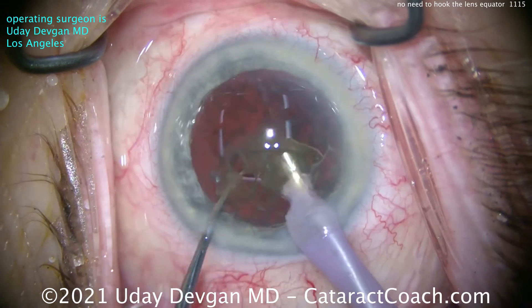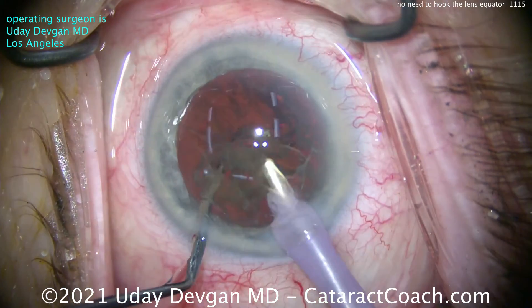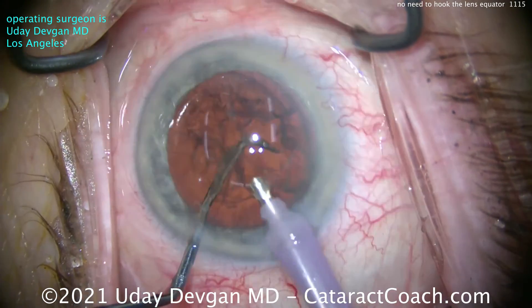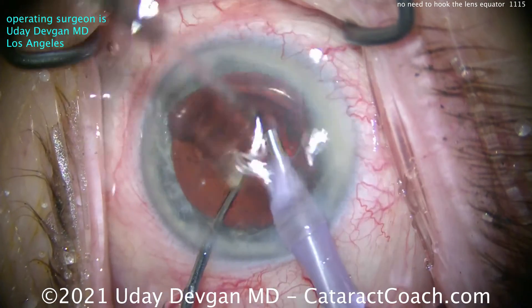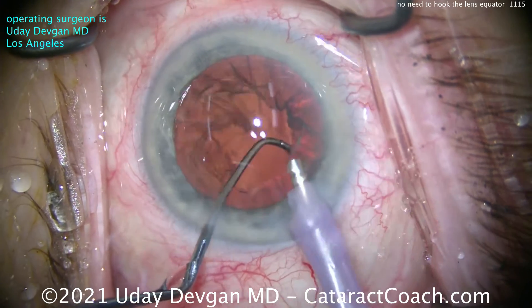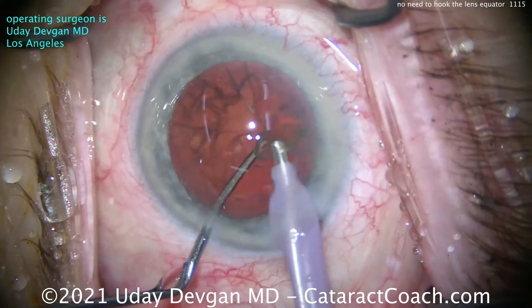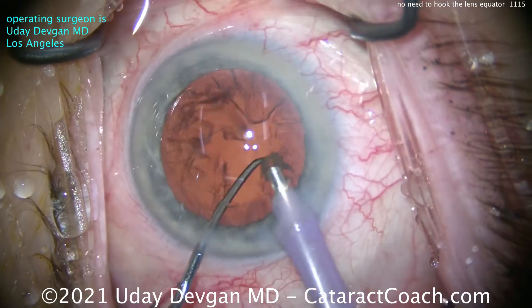It works very efficiently. You can see the nucleus can be removed in a minute or so. It's a very stable and repeatable technique. This is a nice way to learn chop — I call it combo chop. It's been described by many other surgeons; this is nothing I've invented. It's very efficient and very safe.